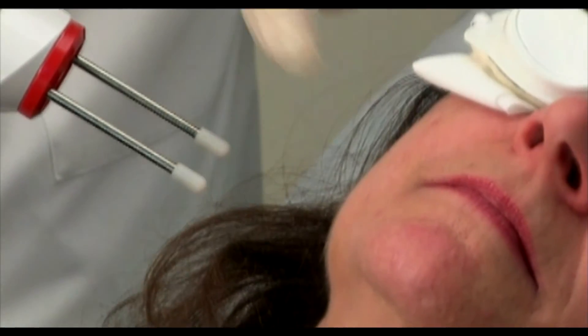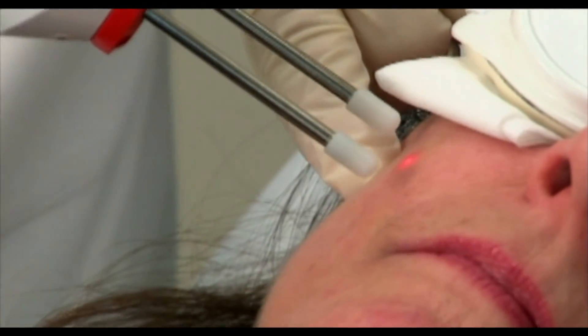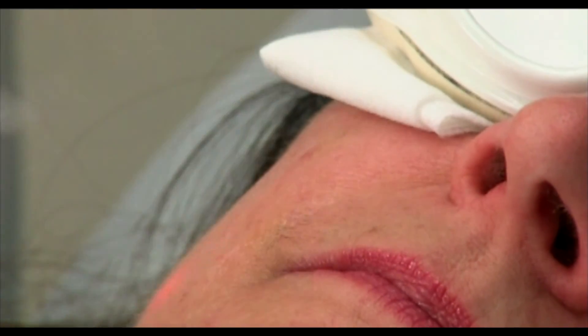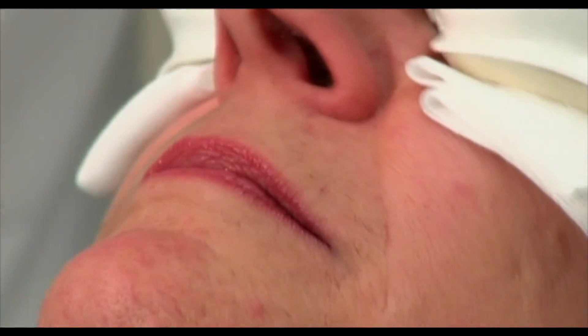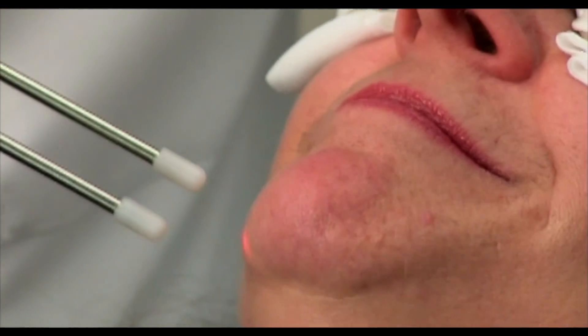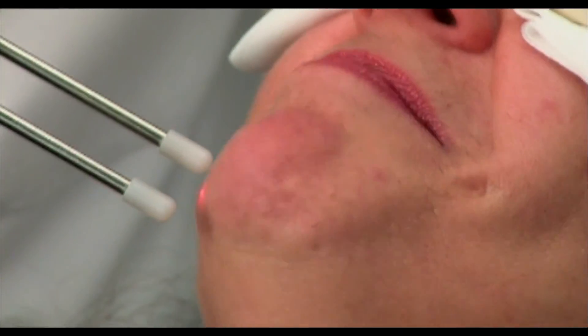Back to this side now. How are we doing? Fine. Not much discomfort? Not at all.